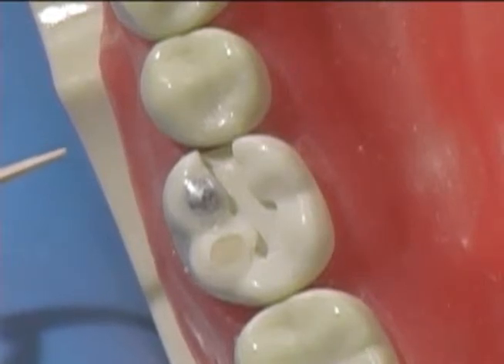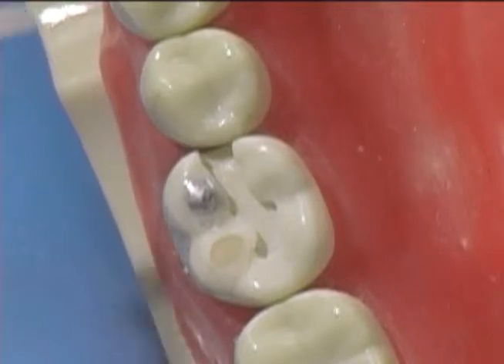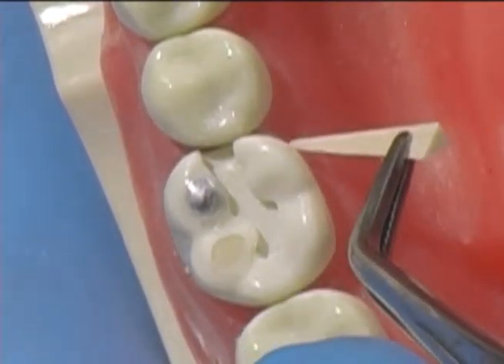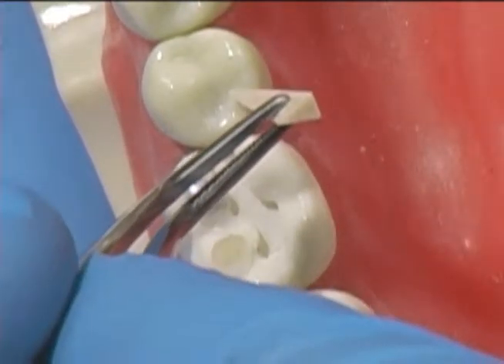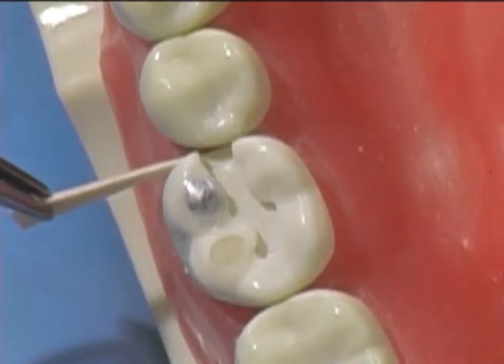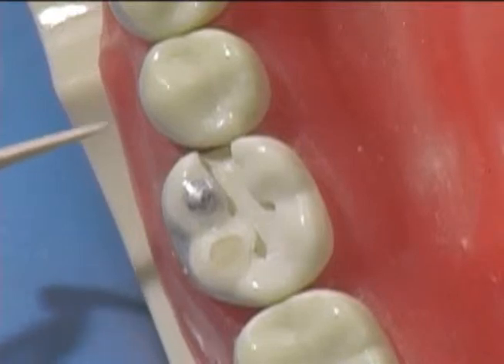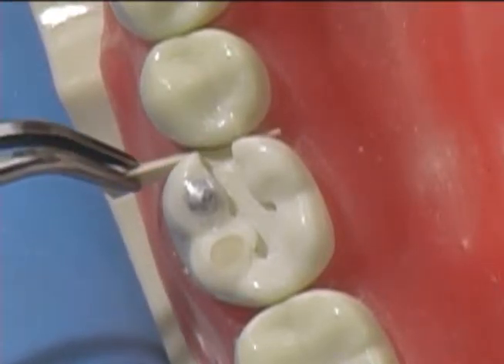When a preparation is clearly more greatly gapped on the buccal than on the lingual, and as we can see in this preparation, the preparation more closely in the gingival box almost touches tooth number 20, and on the buccal aspect, the gingival box leaves a little more gap, then it's very obvious that the wedge would be better placed from the buccal.